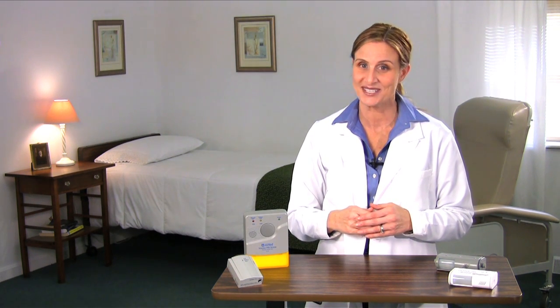You've just seen an overview of the PIR motion sensor alarm systems by Alimed. Once you've selected the PIR system that best meets the needs of your patients or residents, please be sure to see the appropriate video for more detailed information on use, setup, and features.